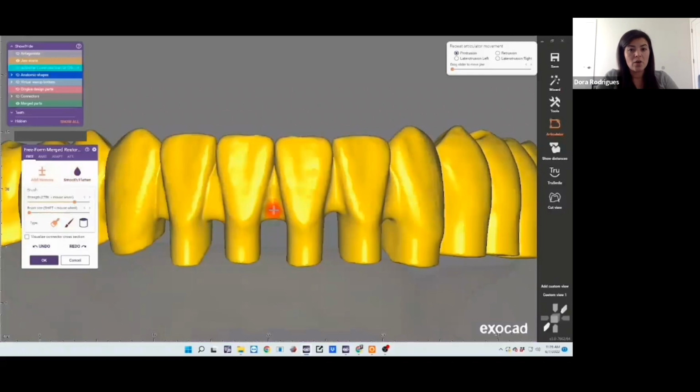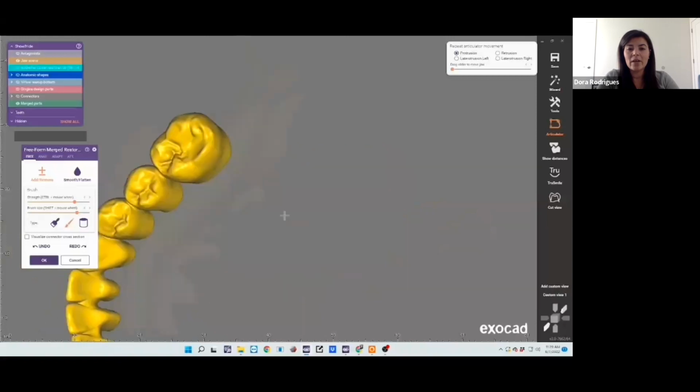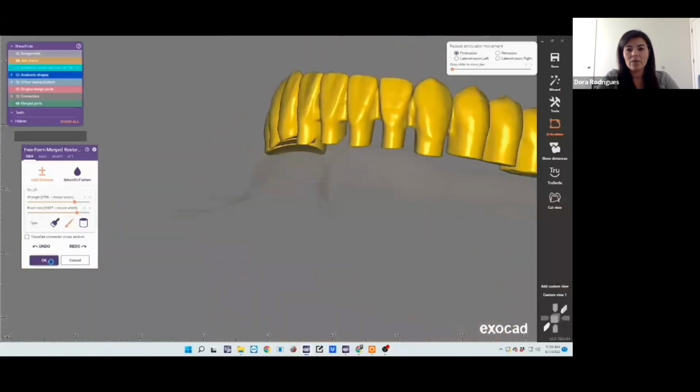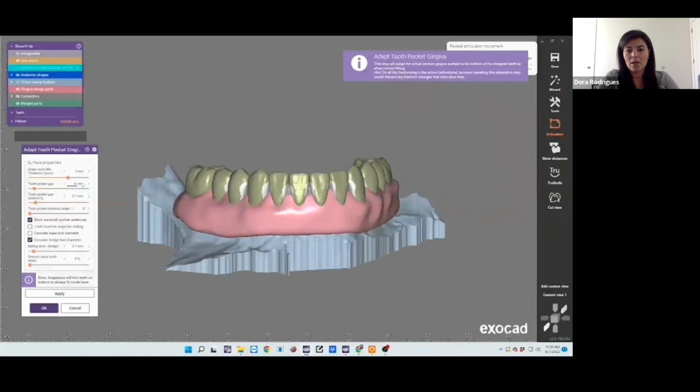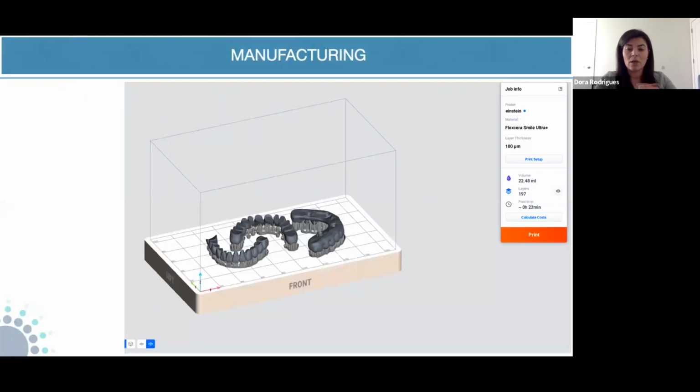One thing, the connectors though, I am very, very detail-oriented with them. I am very careful, making sure that all the indentations of those connectors are good, because I want my base to fit on my teeth, and I don't want to have that much work in my assembling. So I want to make sure that all the gingiva fits into my papillas. So once we're done with the designing, the file is ready to send to the printer.